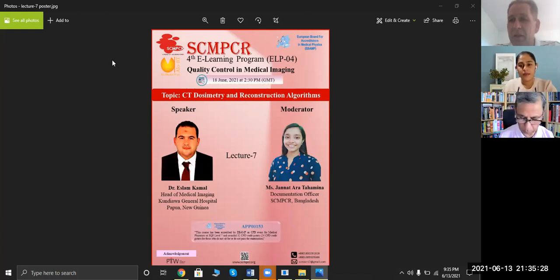That's the reason why I said if you would like to look at image quality, let not only one person look at the image quality, let 2 persons look at what they see. I mean, your eyes may see something different than the other ones, and especially a person with glasses and without glasses do see differently on image quality. And I can assure you that you should have at least 2 persons looking at your image quality. And talk to your operators again.